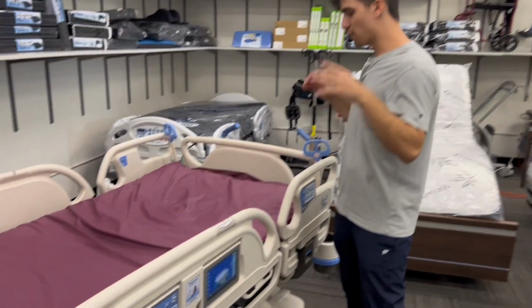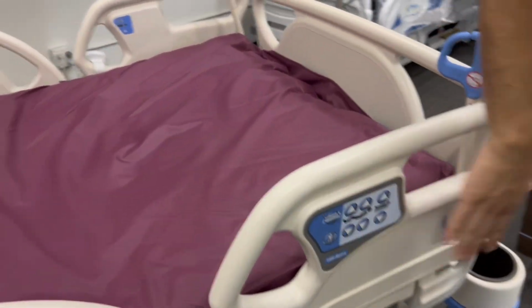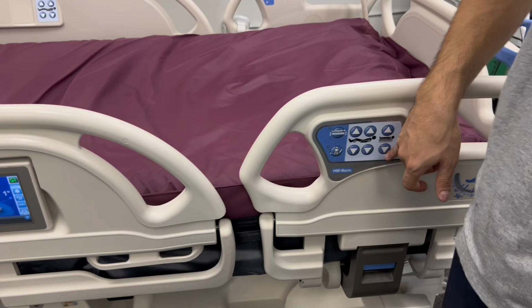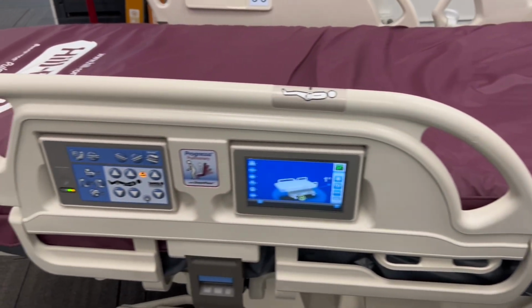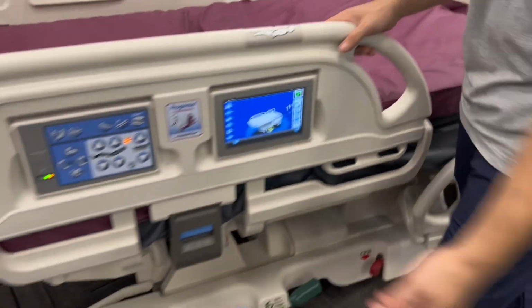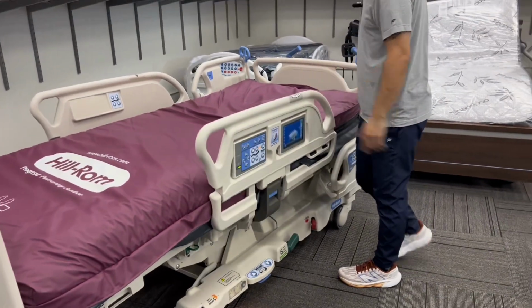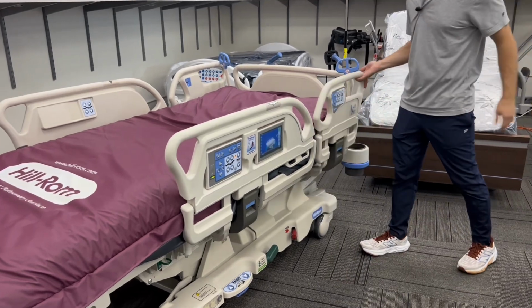So starting from the left side of the bed, the left and right side are exactly identical as far as railing design, button layout, and function. Both of these railings do drop down. Push the green latch there, the blue latch there, drops them down. You bring them back up to lock in place.